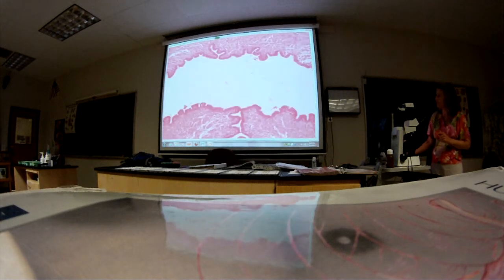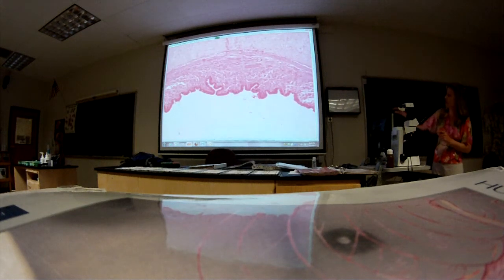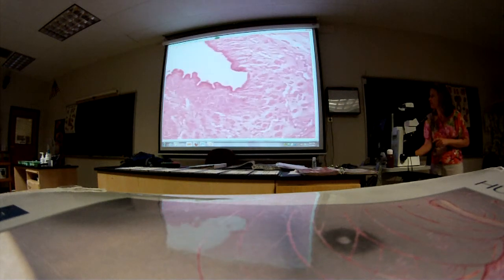So this is showing that opening. What was that called? Spongy urethra. Yeah, it's a spongy urethra. So then this tissue surrounding the spongy urethra, that's the what? Corpus spongiosum. Okay, so corpus spongiosum, and it could go around the edge.